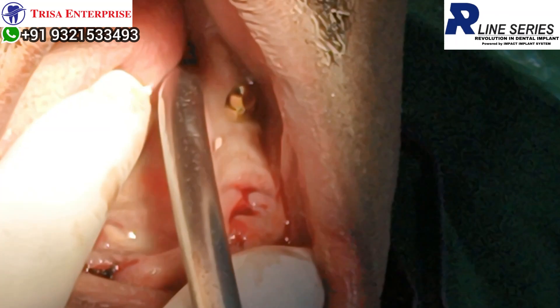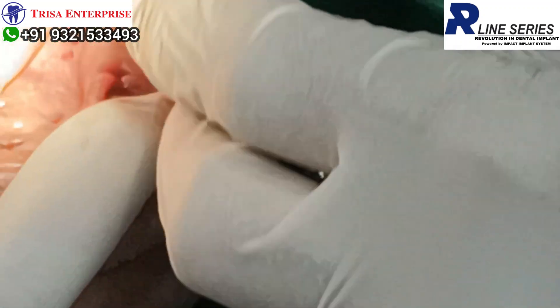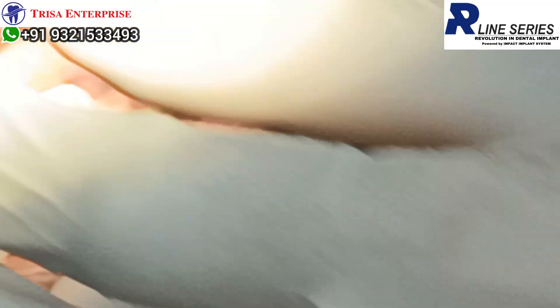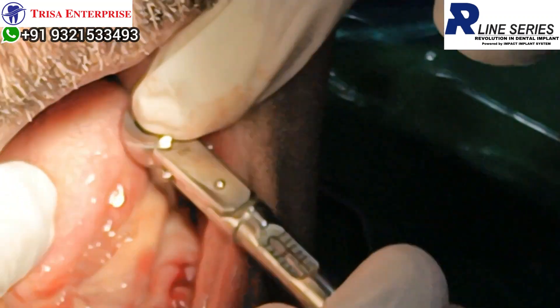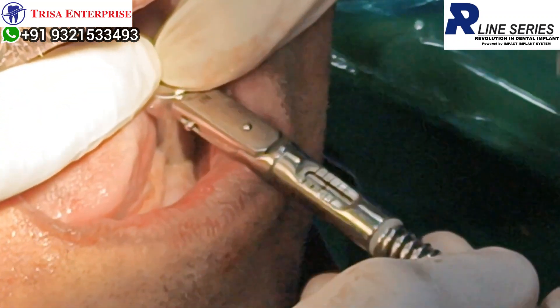So now you put the driver on top of it. And now you can place the inside towards you and ratchet.